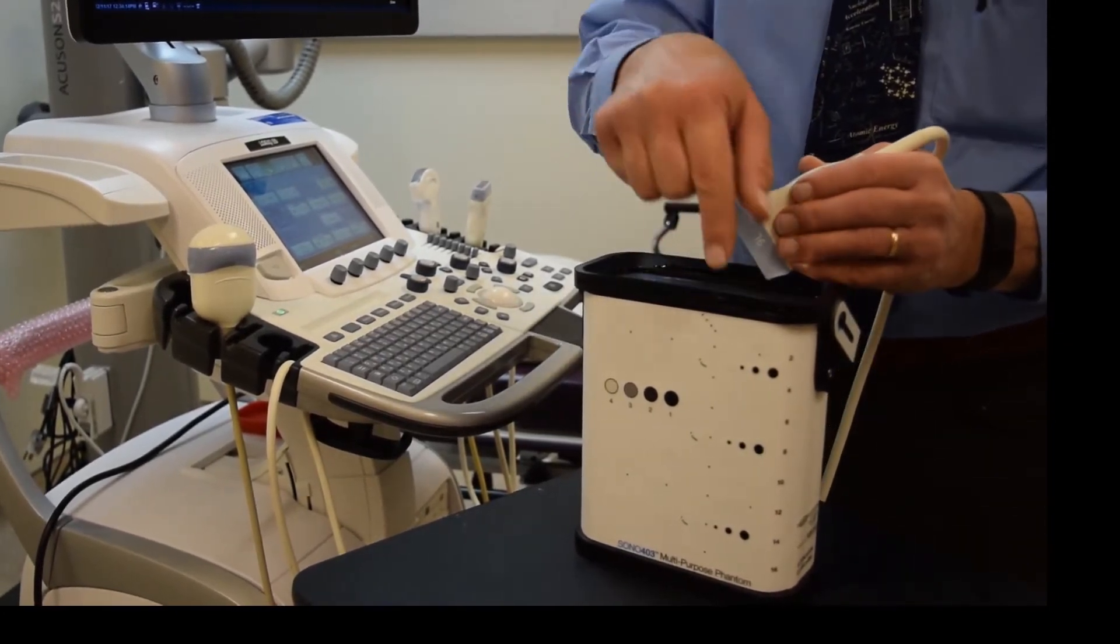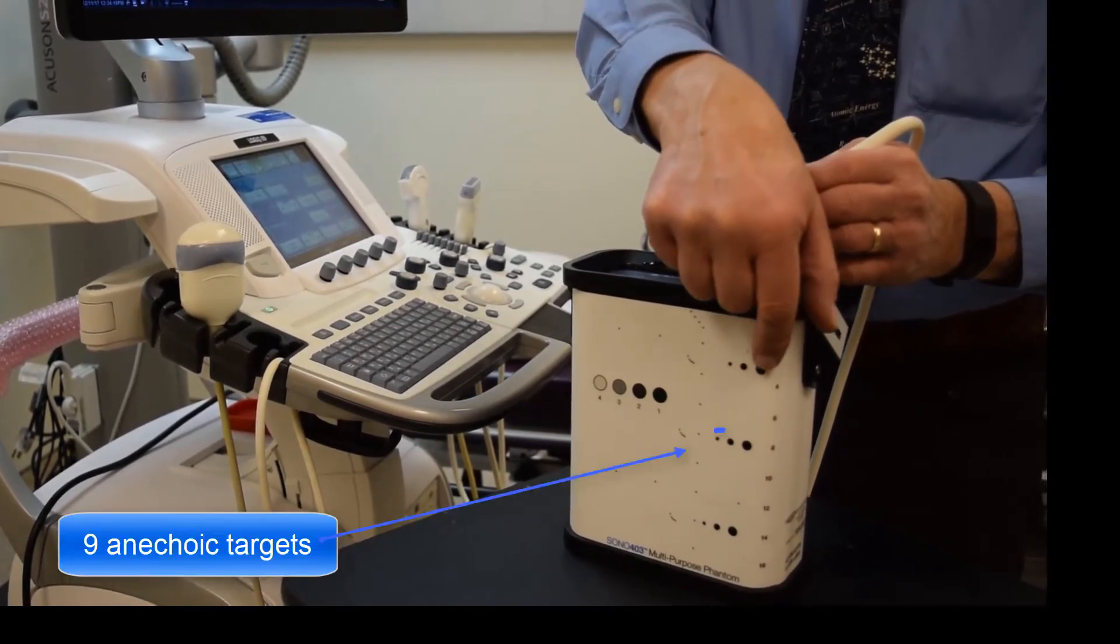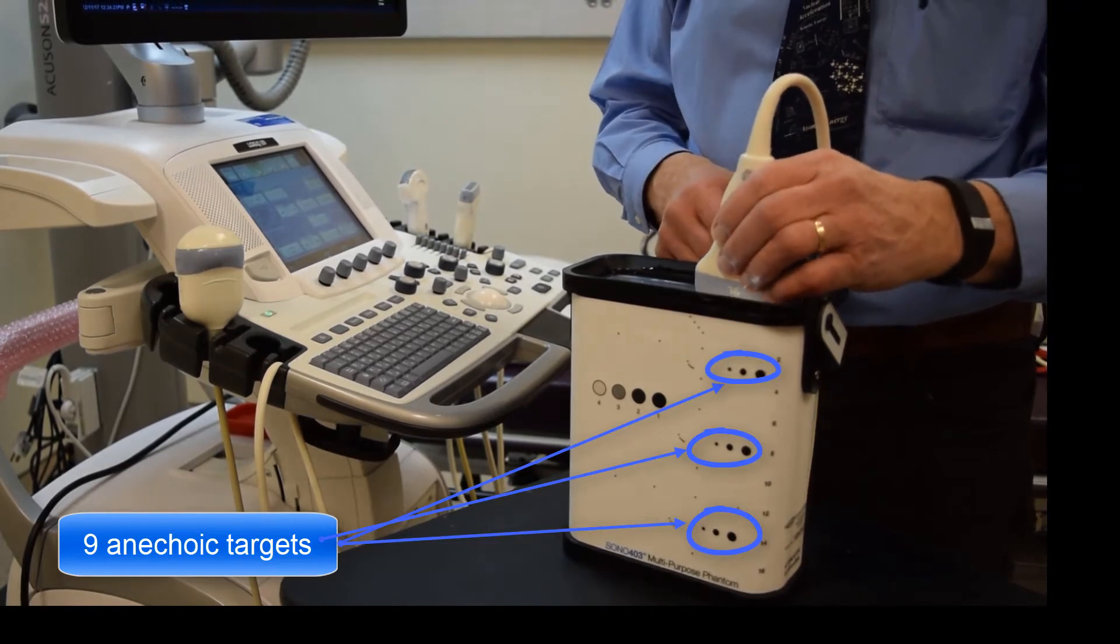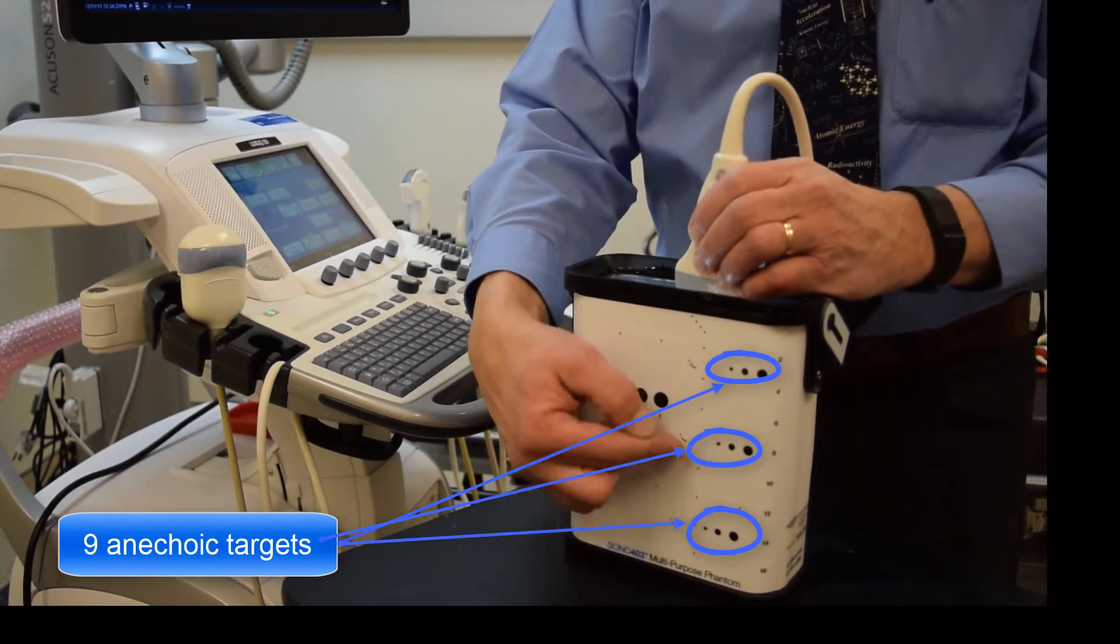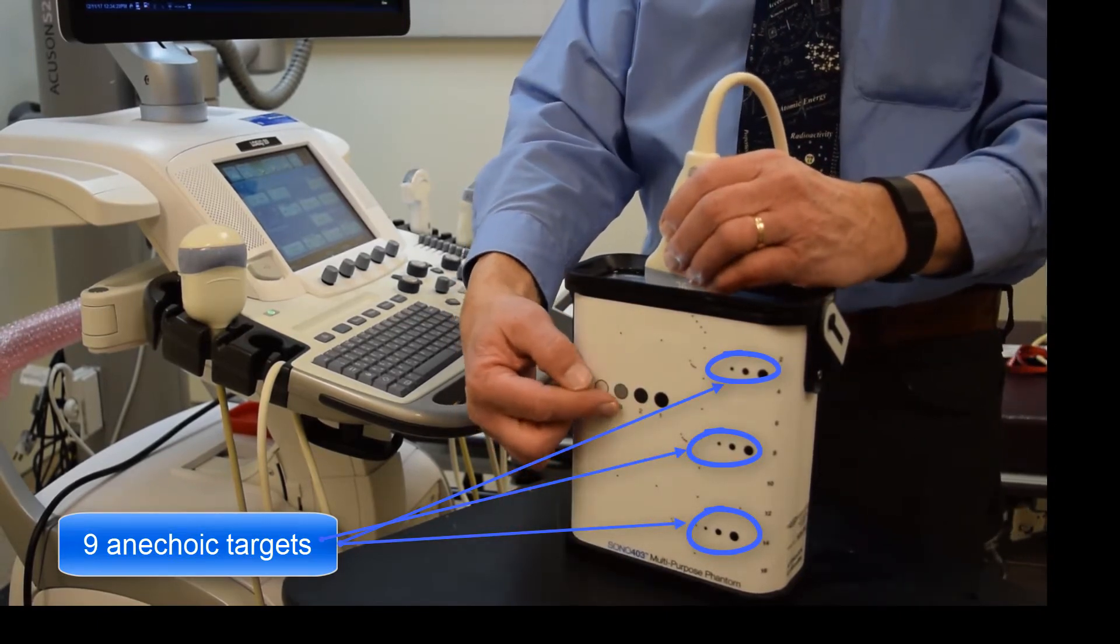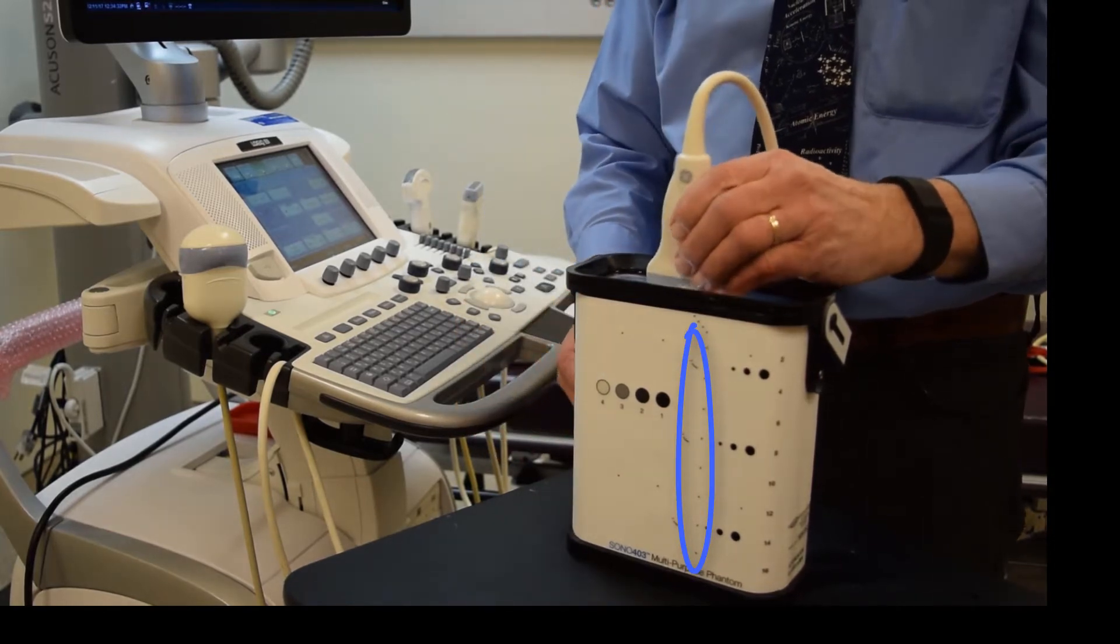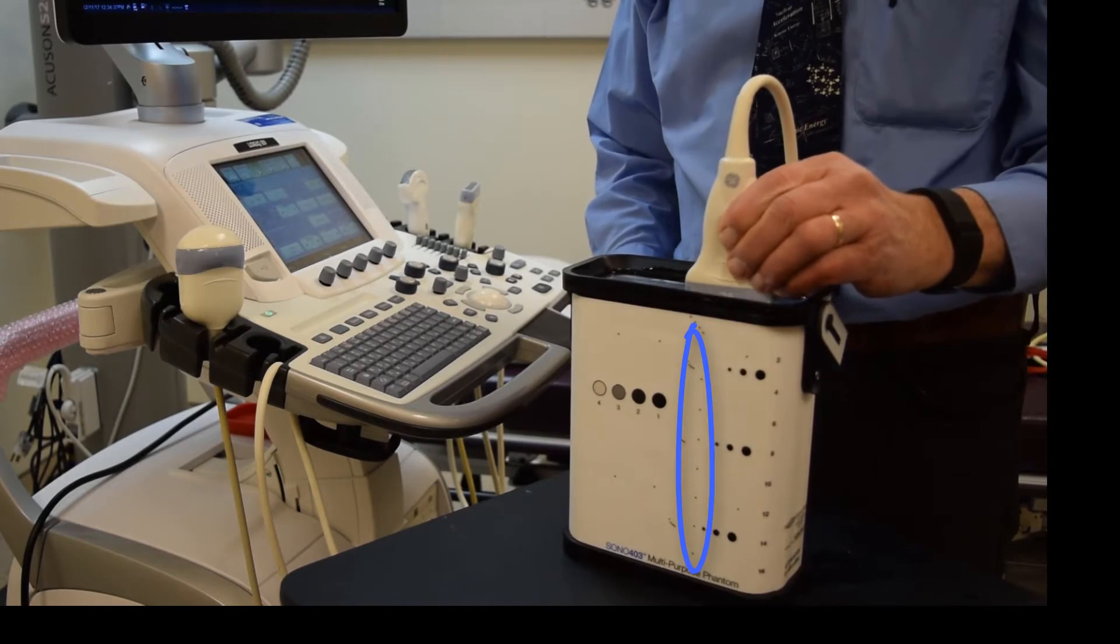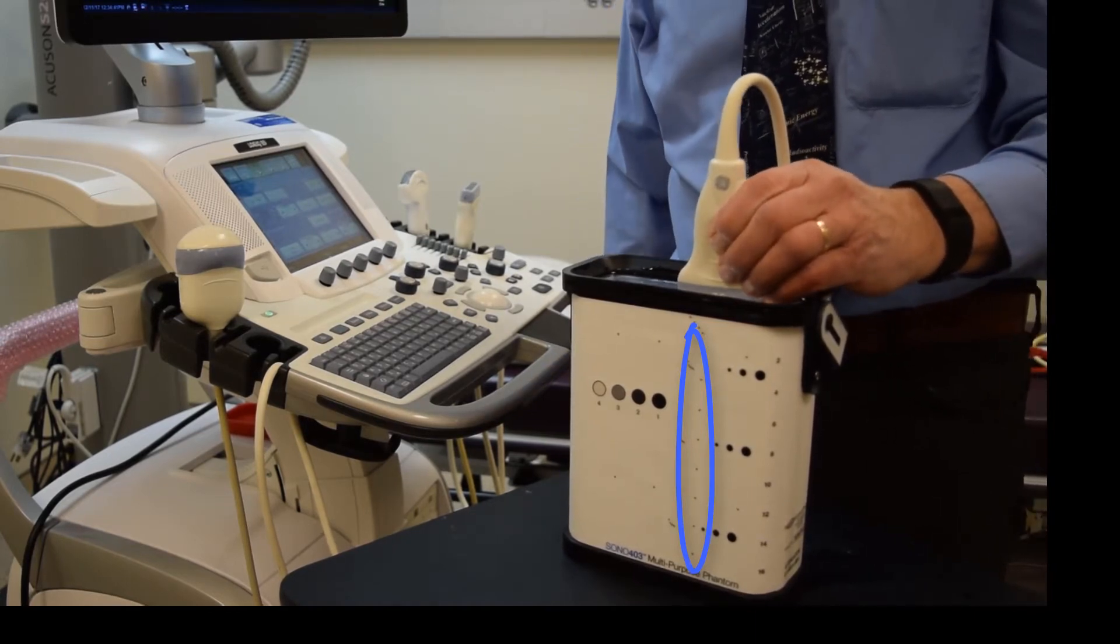There are a number of interesting objects inside the tissue-mimicking material. First, there are three groups of three anechoic cylinders whose axes are perpendicular to the side walls of the phantom. These have different sizes ranging from 6 millimeters to 2 millimeters in diameter. The phantom has a vertical row of nylon fiber targets, also oriented perpendicular to the walls, spaced every 2 centimeters, primarily for distance measurement tests.